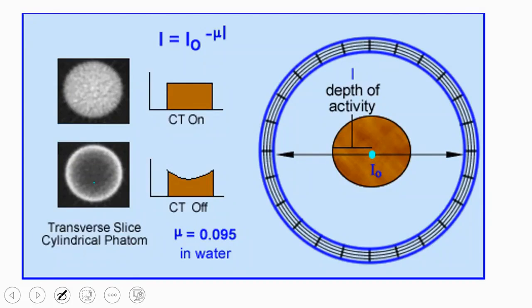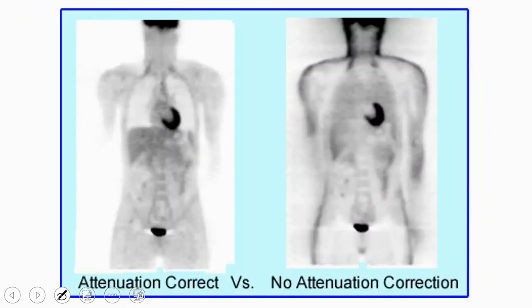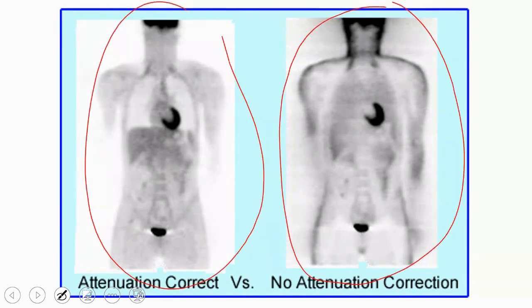One of the factors that affects image quality is attenuation correction, or why I use two methods. The gamma photon is emitted, and in order to be received by my crystal, there are internal organs present, such as the liver and bone. What do these things do? They can cause attenuation and interact with the gamma photon. So, for me, the counts, which are the gamma photons that reach the crystal, will decrease.